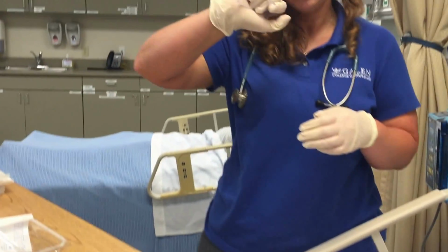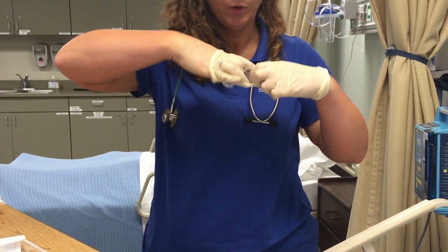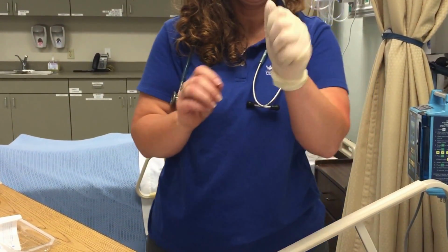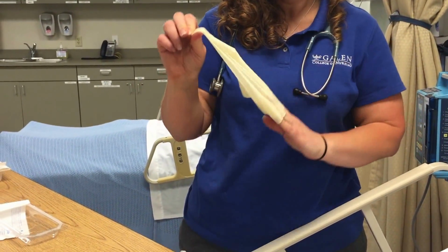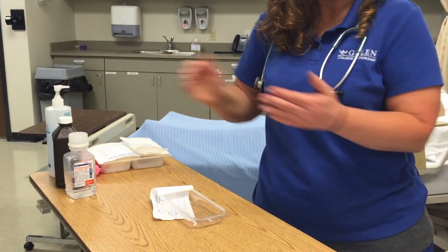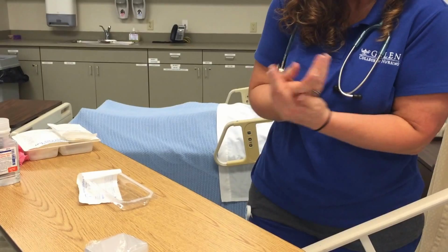Now, because this has your sputum and all that on it, go ahead and wrap it up. You're going to dispose of it in your gloves. Keep it all contained. Okay, just kind of put it here on your other dirty glove, and then dispose of it. And then make sure you perform hand hygiene. All right, we're getting ready to go in between and do different procedures.